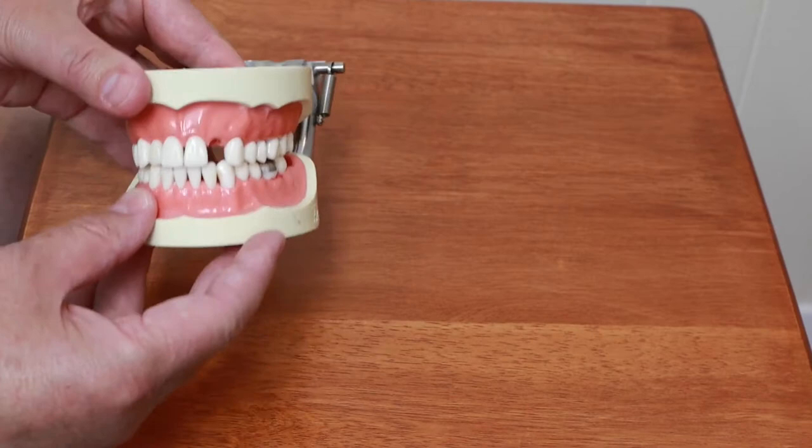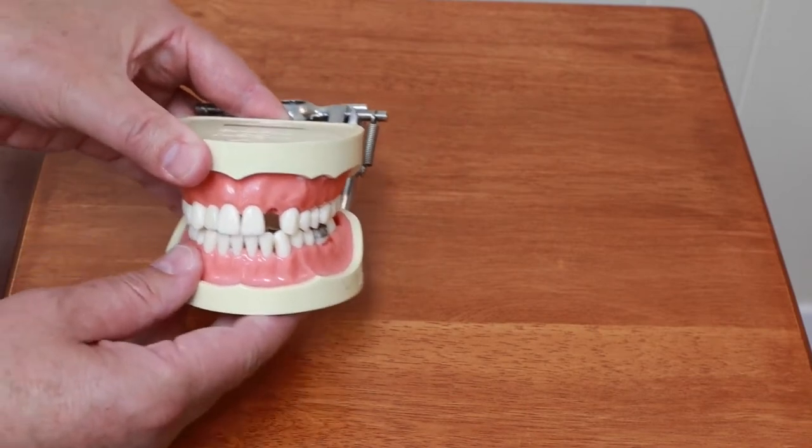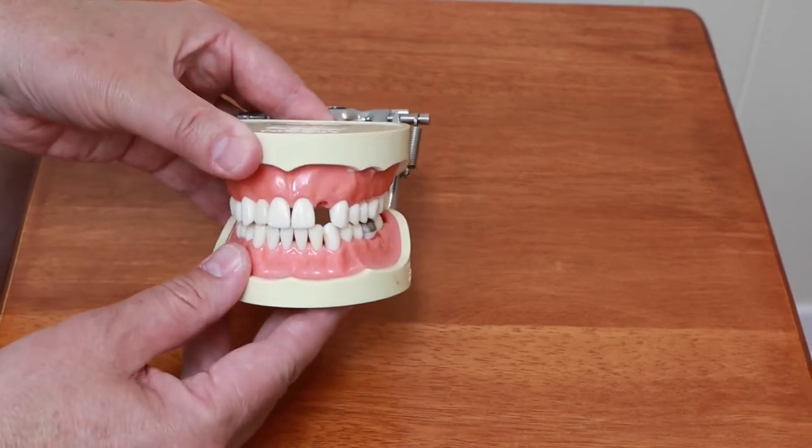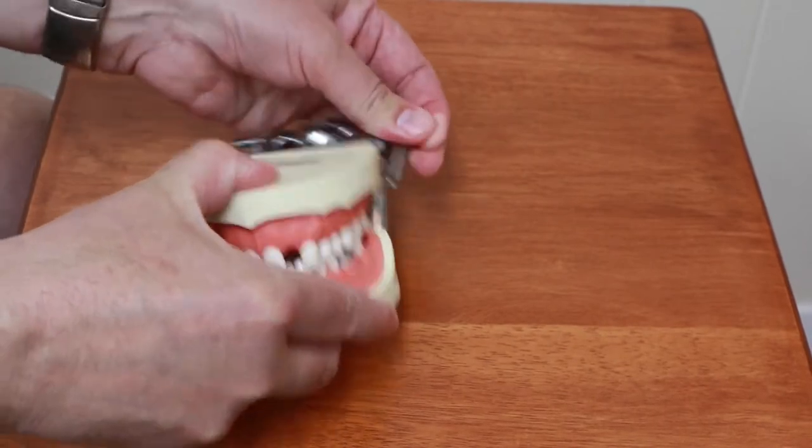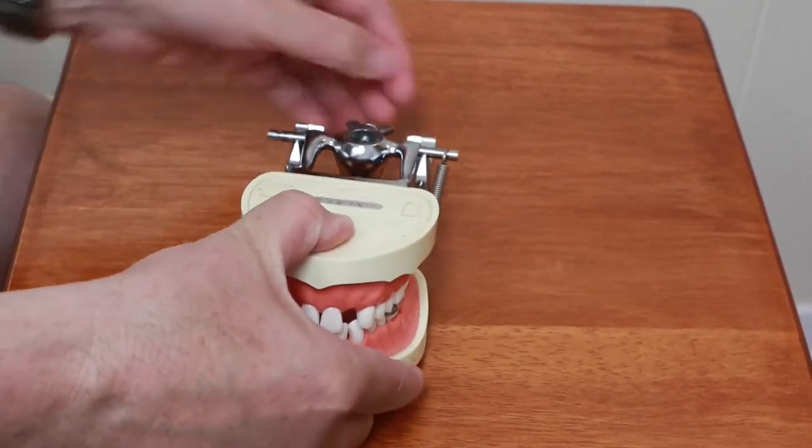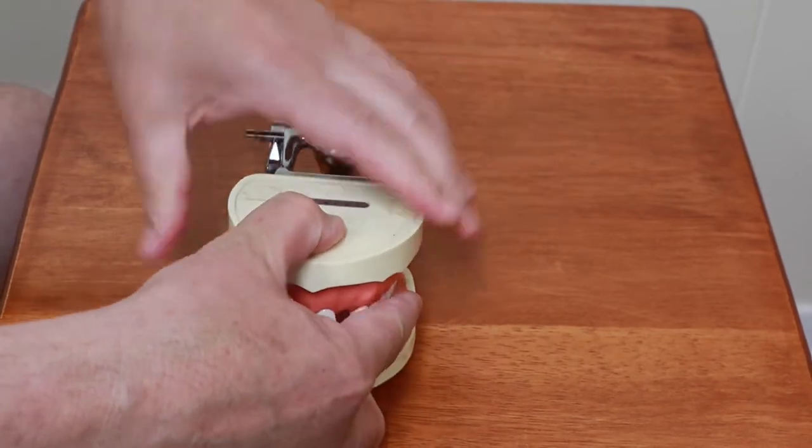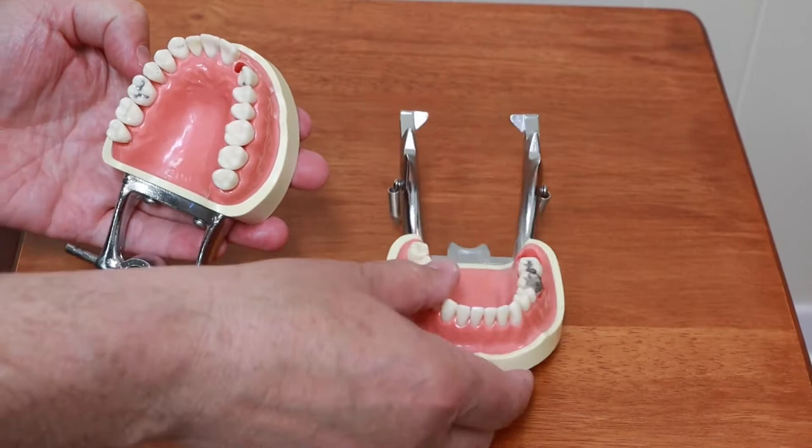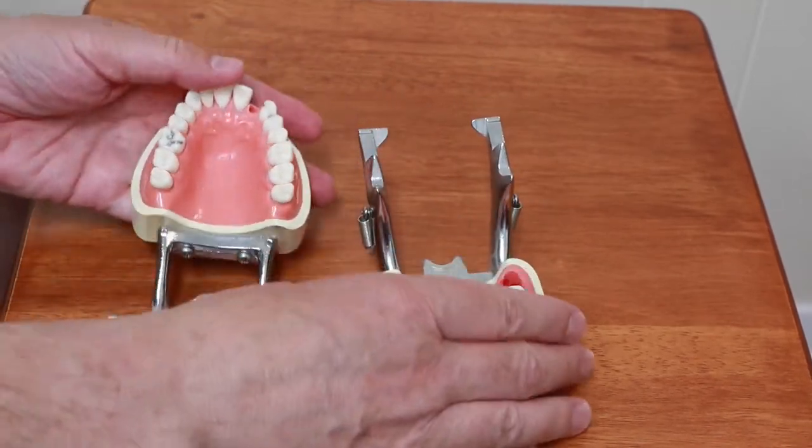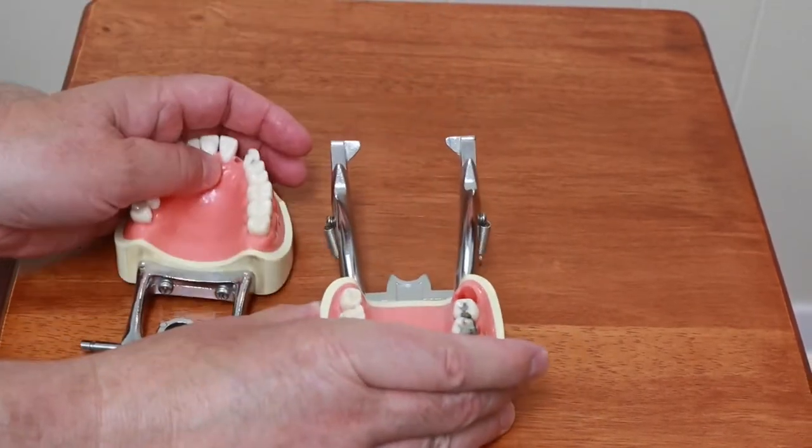The beauty of working on a typodont rather than on a live person is that I just undo a couple springs in the back and the two jaws come apart so I can more easily take a mold of his upper teeth and lower teeth.